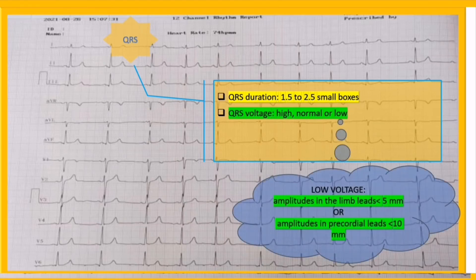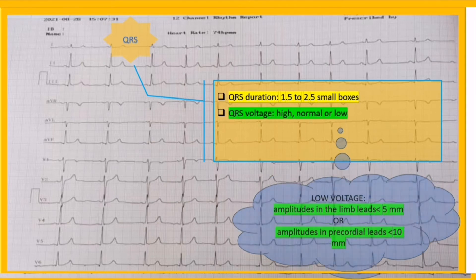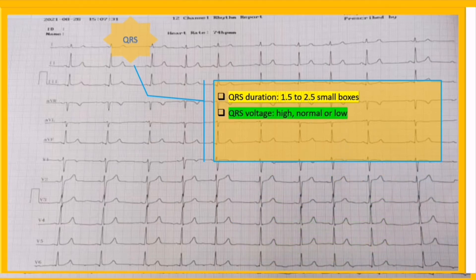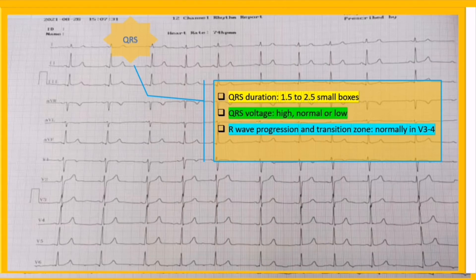The QRS is said to be low voltage when the amplitudes of all complexes in limb leads are less than 5 millimeters, or the amplitudes of all precordial QRS complexes are less than 10 millimeters. On the other hand, increased amplitude favors ventricular hypertrophy. In general, this strip is neither low nor high voltage.